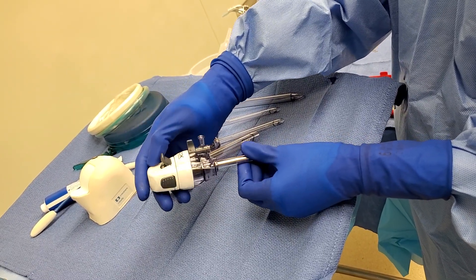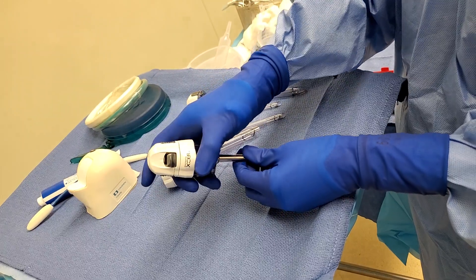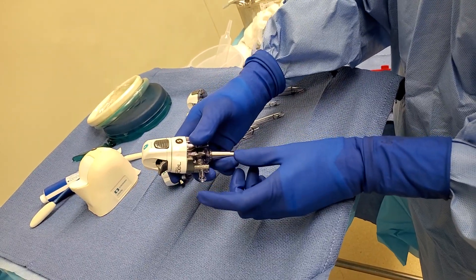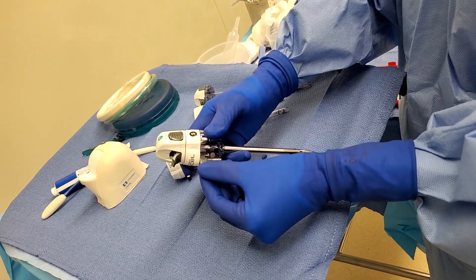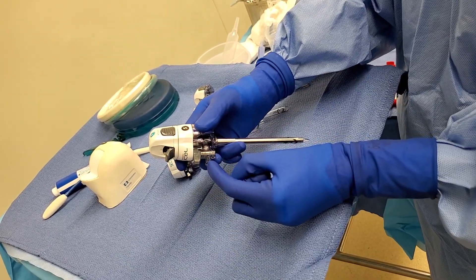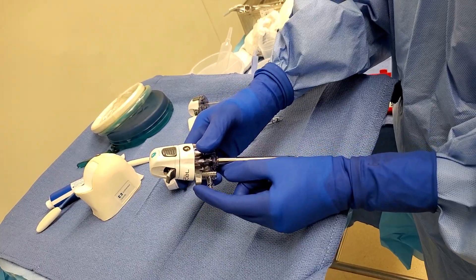An important thing — I made a mistake when I was a student — is not closing this. This is where the insufflation goes in, so when you're ready, you just open it and let the insufflation go in. But to start off, you want to just lock it.